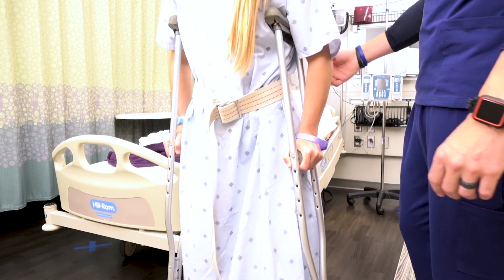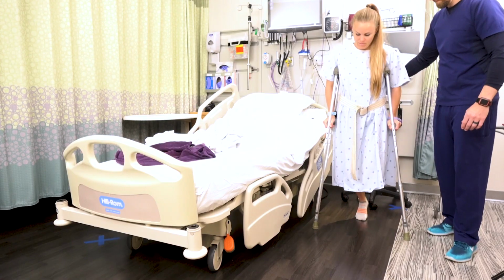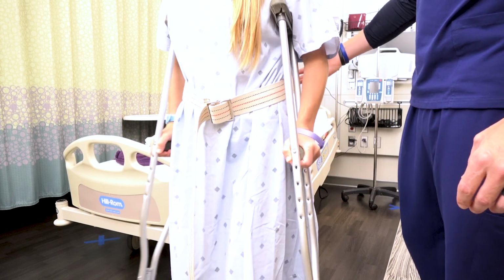Now, if they're non-weight bearing, we use a swing gait. We'll have them elevate their bad leg, advance their crutches, and swing through on their good leg. This is a swing-through gait. It's kind of hard to get used to, but if you help them out, they'll get it.